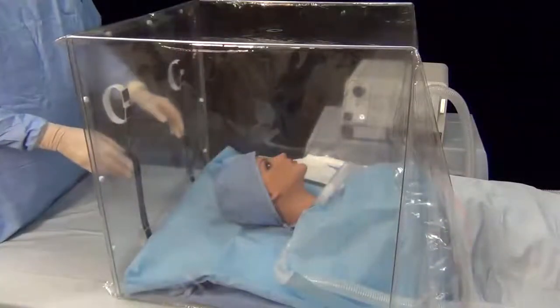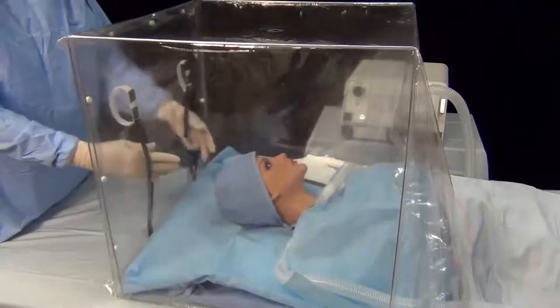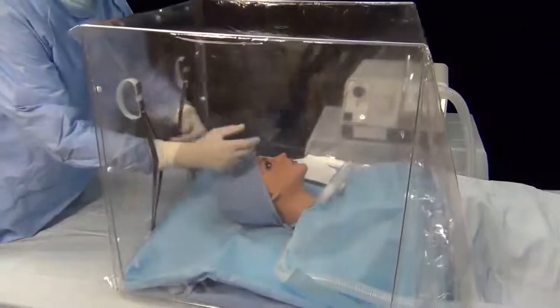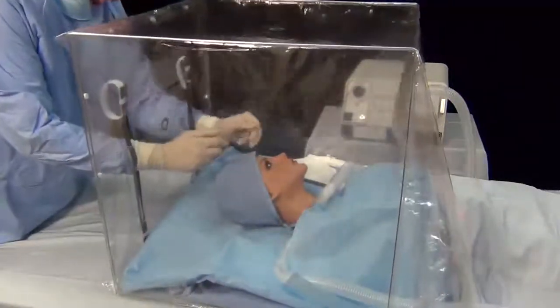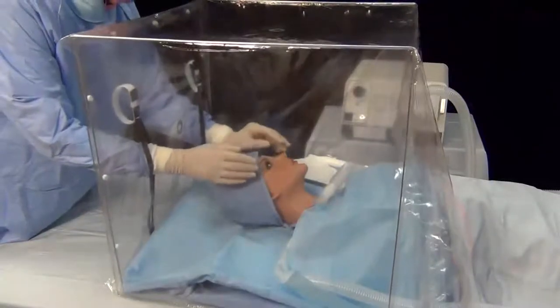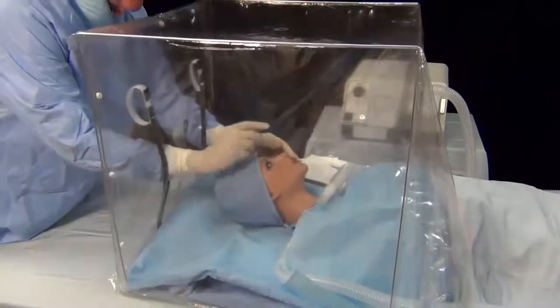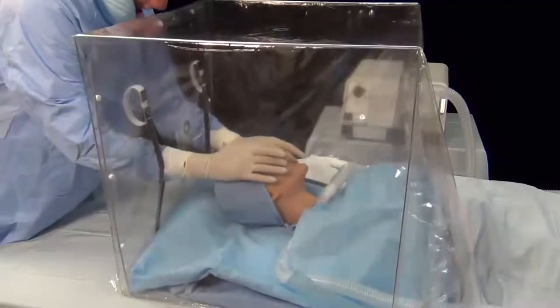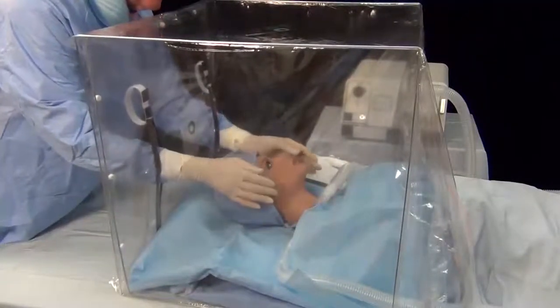Now that the access ports are open, you have free access into the tent with your laryngoscope, your endotracheal tube, or whatever the need is. And through the clear plastic top, you can clearly see how to put the tube in.